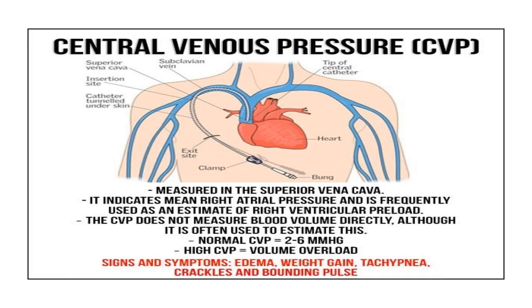We'll go forward. Starting at the very beginning, our CVPs, central venous pressure. Remember I told you everything starts in the right atrium. All the fluid is brought to there, and the right atrium decides who gets to come into the heart and who does not. So this catheter is put up through the vein, and it drops right there at the right atrium, and it measures the pressure outside the right atrium to give us a basic idea of fluid volume status. Though it can't give us the exact fluid volume, it can tell us based off the pressure that is inside that atrium how much fluid.